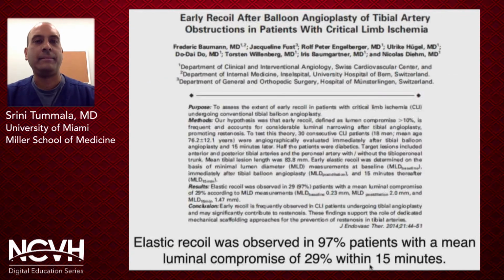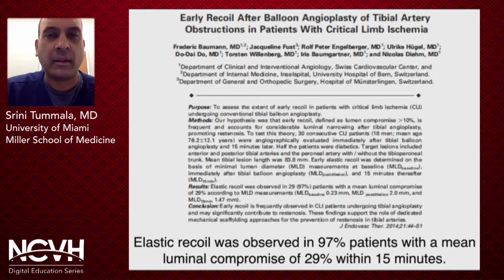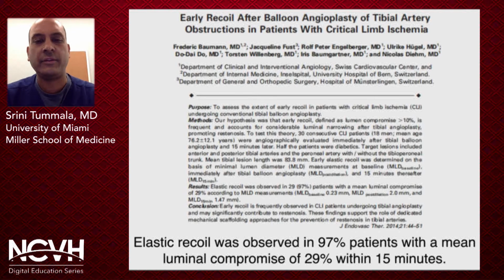So when it comes to treatment, a key concept is proper sizing of your angioplasty balloon. This is a study that was done dealing with tibial vessels, but it applies to other parts of the body as well, in my opinion, especially when you're dealing with small vessels below the ankle. This is a study performed at the Swiss Cardiovascular Center where they did an angiogram of a tibial vessel and performed intervention, in this case angioplasty.